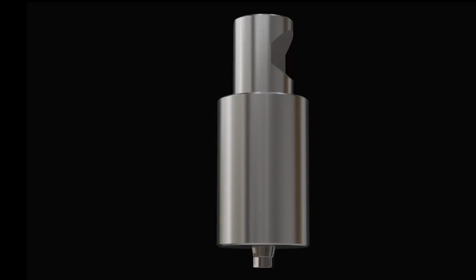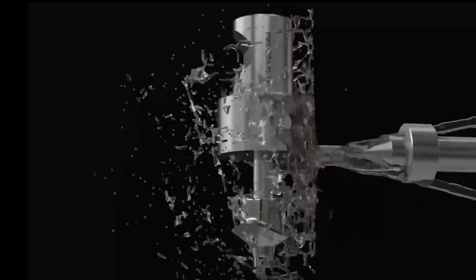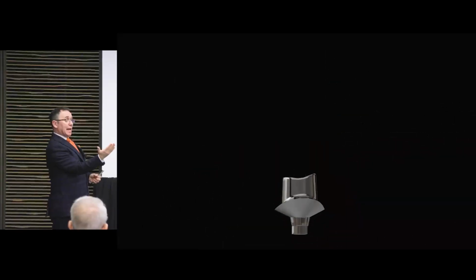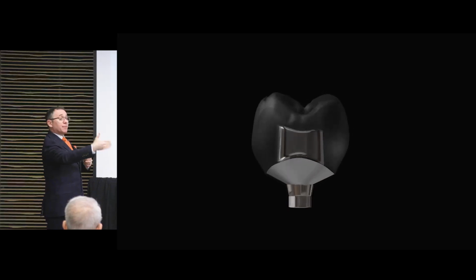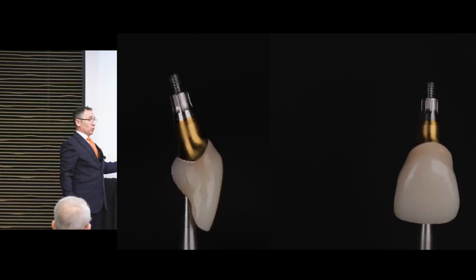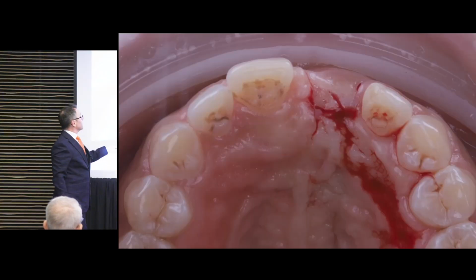Yeah, so it's exactly that. And as Martin mentioned, this is where we're going to go to a custom, but purely because of the timing. To make the best use of that angle cut, you've got to have the scan body with that slope facing buccal. That allows you to utilize the angle cut. If you don't do that, then we're across to one of the customs. So that's why this was a custom in this particular instance.